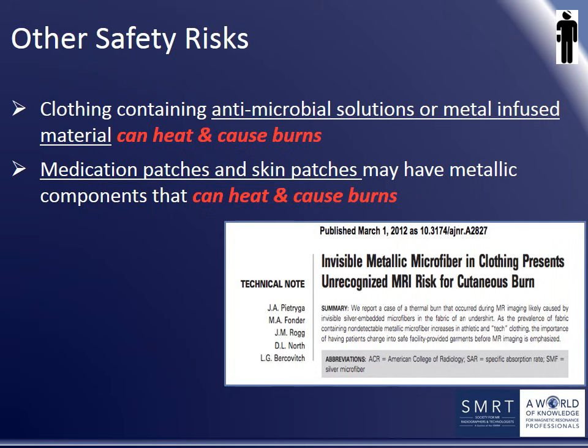As well as removing obvious metallic items from a patient prior to scanning, unrecognized safety risks include clothing containing metal-infused material or antimicrobial solutions, which often contain copper. These materials can heat and cause radiofrequency burns during MRI. Therefore, it is important that all patients should be changed into appropriate hospital clothes that are free from metallic parts prior to MRI. Medication patches and skin patches that have metallic components may be hidden under clothing. These can heat and cause radiofrequency burns during scanning and must also be removed before entering the scanner room.